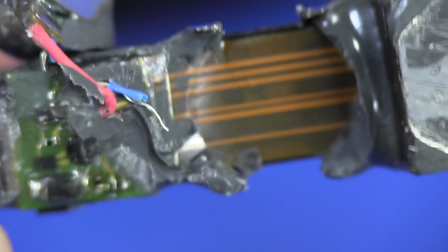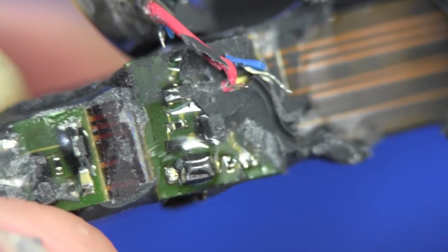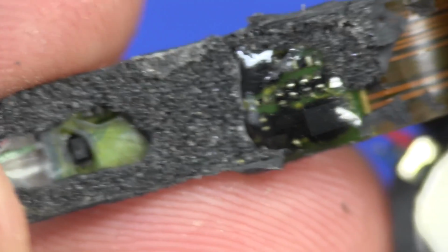That's your main accelerometer. Whether or not it has like a secondary MEMS one, I don't actually know yet. But you can see all the boards joined up there, and that flex membrane would go right under that, and you can see it up there as well, joining onto the main processor board. And then another, you can see it in there, joining up all the boards together. And look at that, on the bottom side of the board, more components on there.